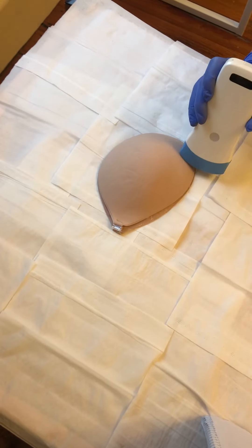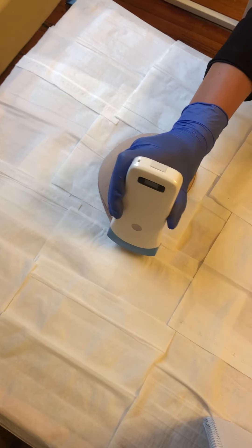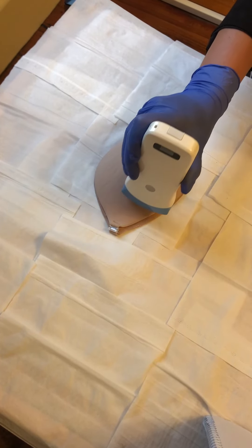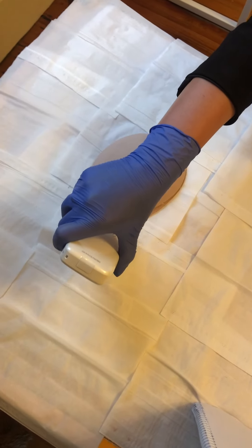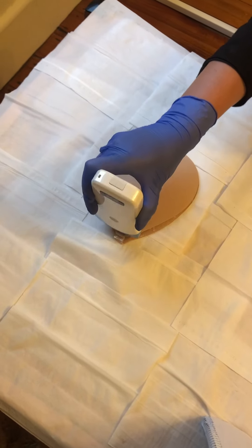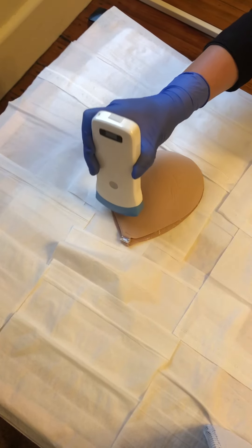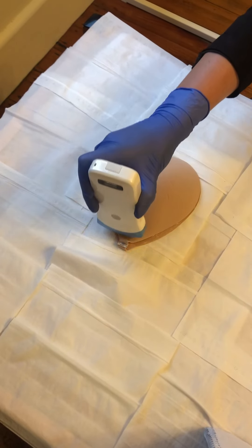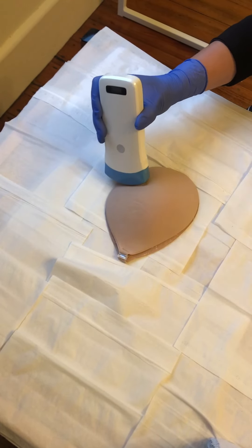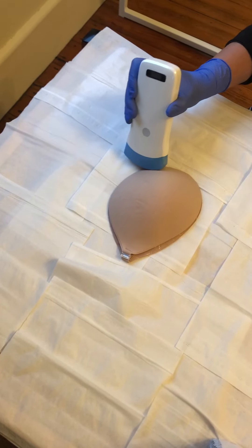So moving superiorly, inferiorly, just repeating that contour content and again you see some overlap of the areas we scan to make sure that we're covering all of the breast tissue and just slightly out of the breast tissue, just slightly heel toe-ing to get the best angle. I'm moving back superiorly from the inferior, finishing that scan again just slightly out of the breast tissue to make sure we are visualizing everything.